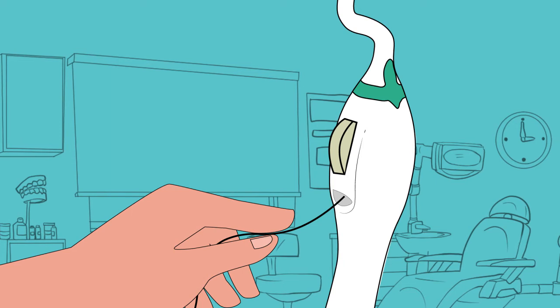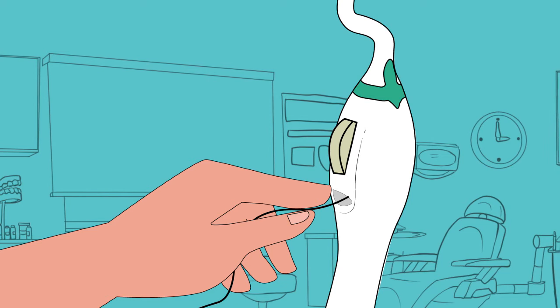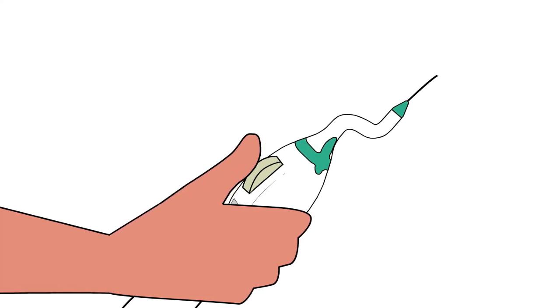Insert the AutoFlosser floss leader section into the loading area until it meets slight resistance. Turn the drive wheel in a direction away from the tip to move the leader end to the exit of the AutoFlosser tip.